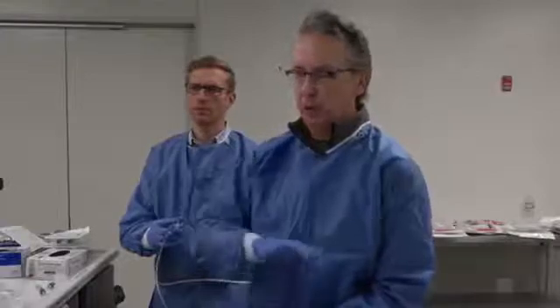What we want is a mound that is concentrated underneath the lesion and has a sort of dome shape to it. The other advantage of a more viscous fluid is that almost invariably the duration of the mound is longer than what we see with saline. So let's demonstrate that. We're going to use, again, our standard technique.